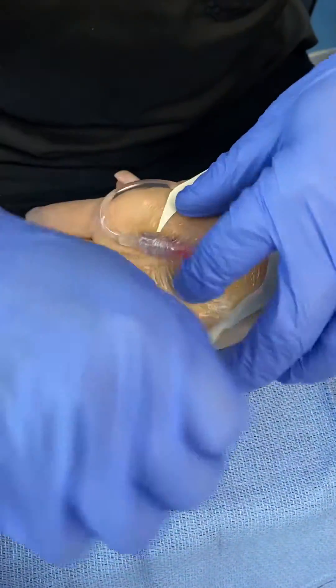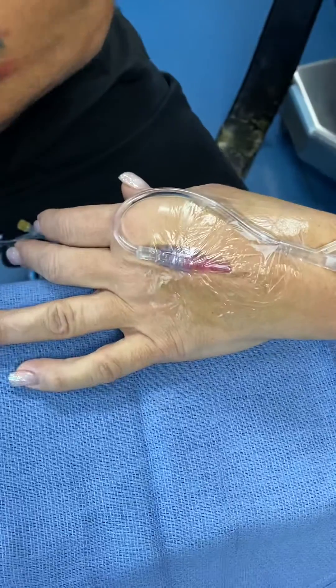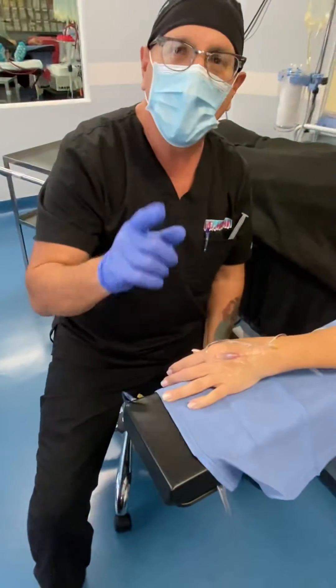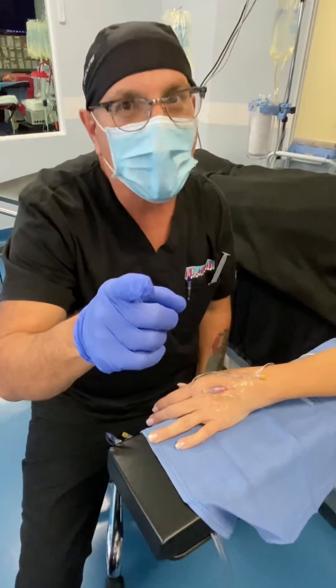I find that almost all of our patients get turned over into the prone position, and then I'll put tape there and tape there — I'm not going to show you that. That's how we do it. Remember guys, keep your vaporizers full and stay vigilant.